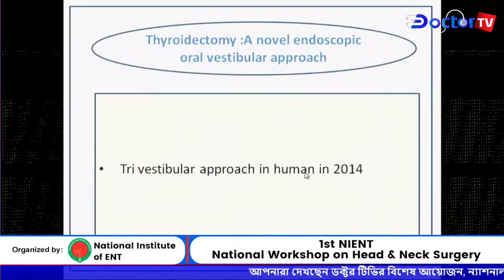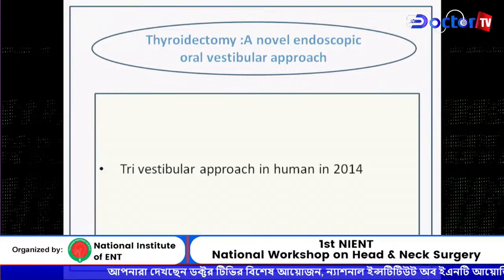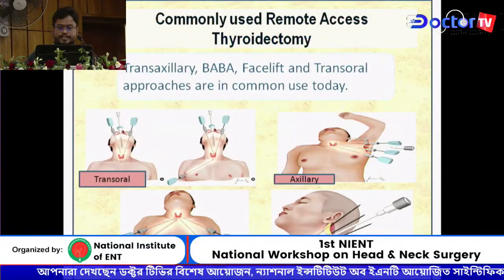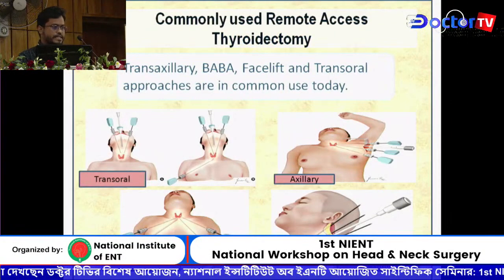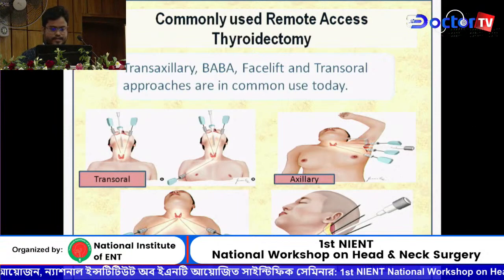The first transoral endoscopic thyroid surgery was done by the vestibular approach in 2014. Commonly used remote access thyroidectomy approaches are axillary, bilateral axillo-breast, facelift, and vestibular approach.